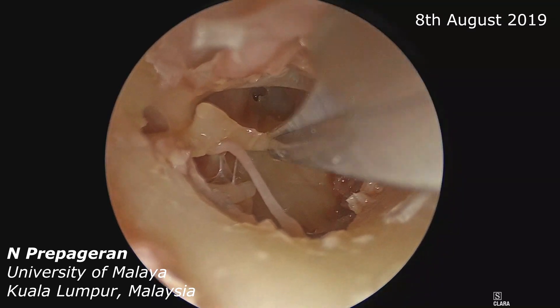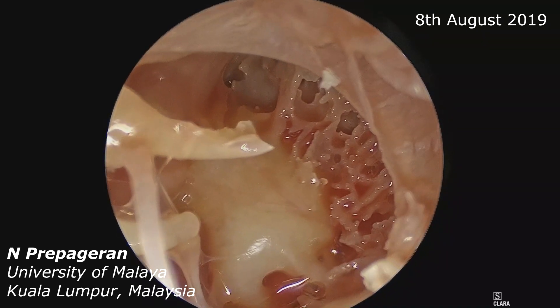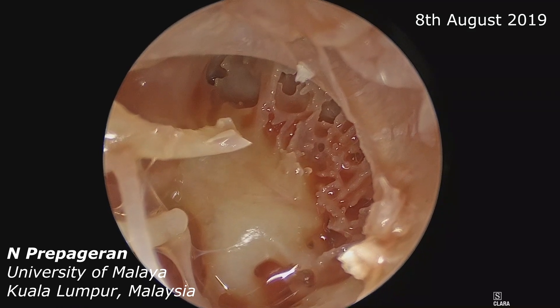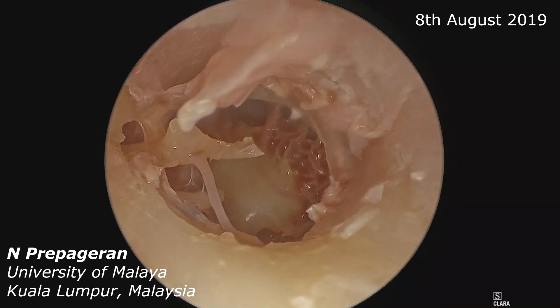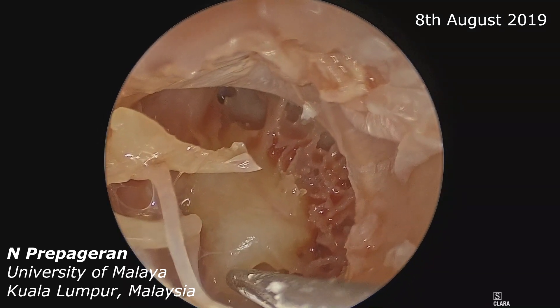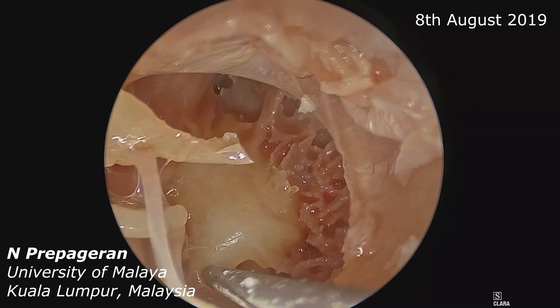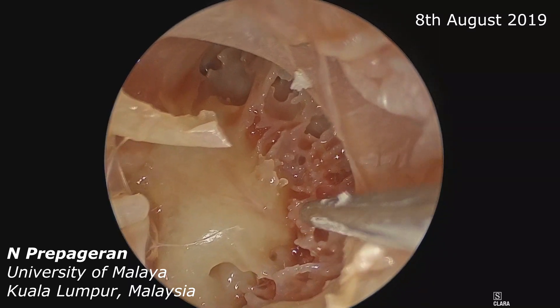Is that clear? You can see the eustachian tube and the round window. Right at the promontory — can you see the Jacobson's nerve? It's bifurcating there. Let me suck out the middle ear space. This is the ponticulus — between the pyramid and the round window niche. The lower part is the sinus tympani, and down here is the funiculus.